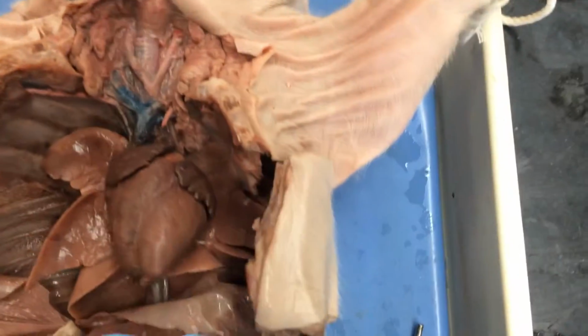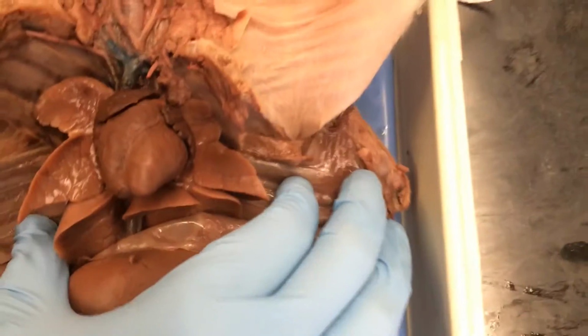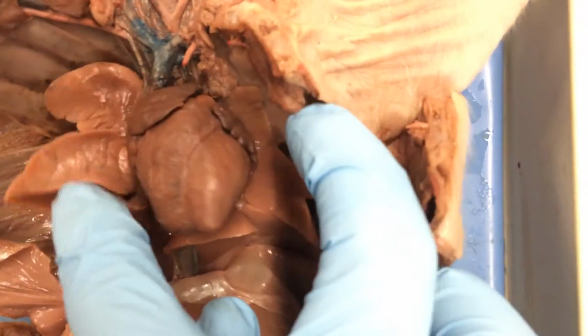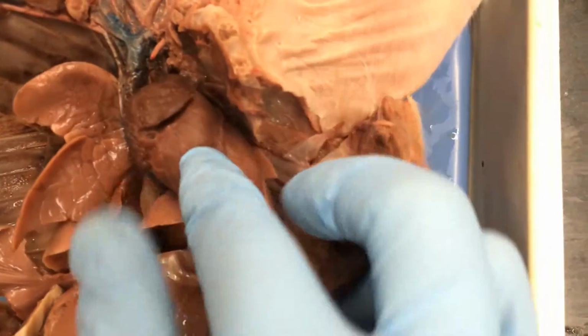We're going to look here today at the thoracic cavity. I've opened the rib cage. This is the rib cage. I've opened this up, and these structures that you see here, these flaps, these are the lungs. This is the heart right here.